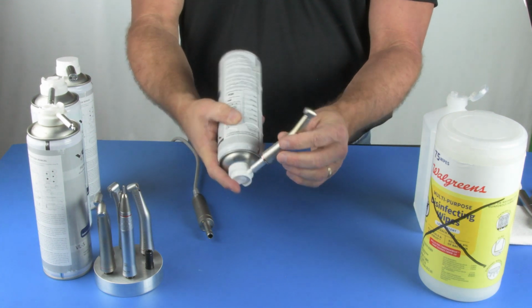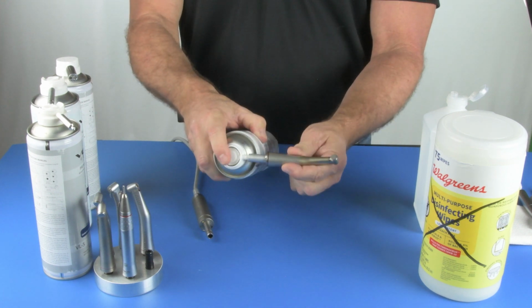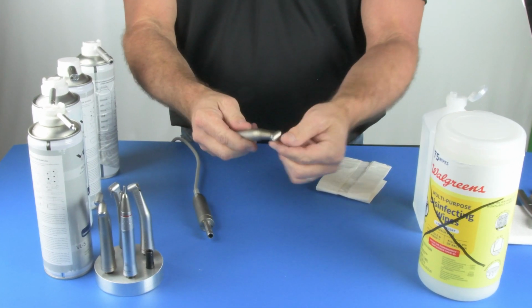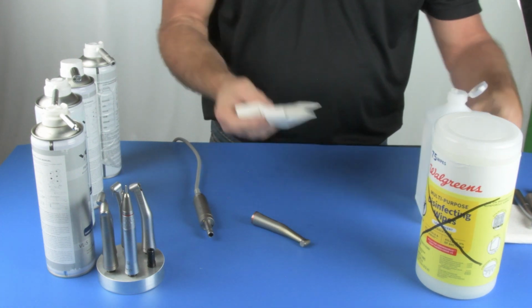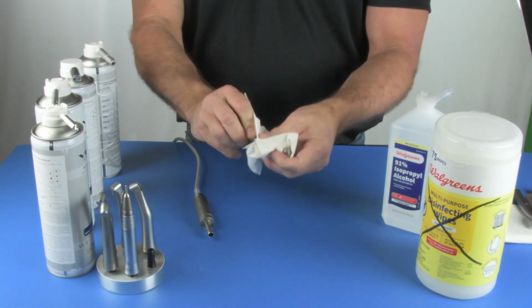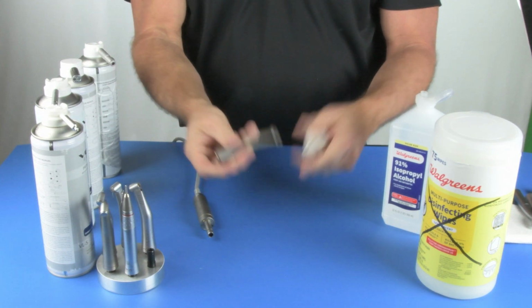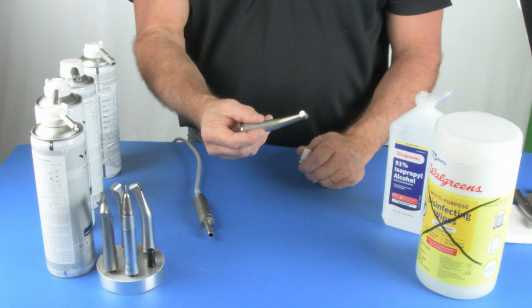So what we're going to do is place it on the E-type adapter. We're going to put it on our Vector spray can. We're going to go ahead and spray it for 2 seconds. Count of 2: 1, 2. We're going to remove it. The handpiece will have some exterior oil on it. We're going to get an alcohol 2x2 wipe, pure alcohol preferably, and wipe off the exterior of the handpiece, which is going to remove 99% of the oil. At that point, you can bag it, sterilize the handpiece as you normally would, and it's ready to use.